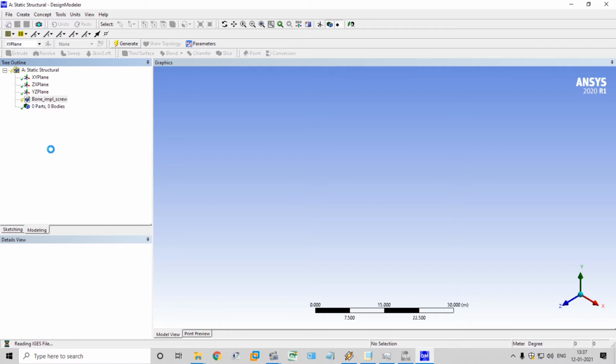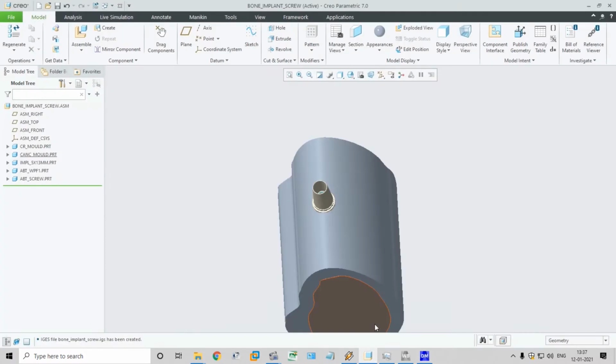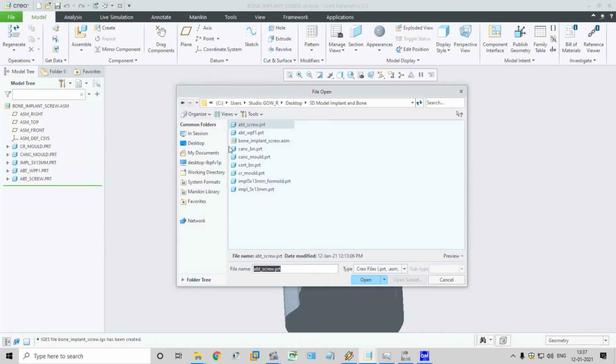Reading that IGS file, the 5 parts: abutment, abutment screw, implant, cortical bone, cancellous bone are displayed here. It will take a moment. This will take 1 to 2 minutes according to the speed of your RAM and processor that we are using.